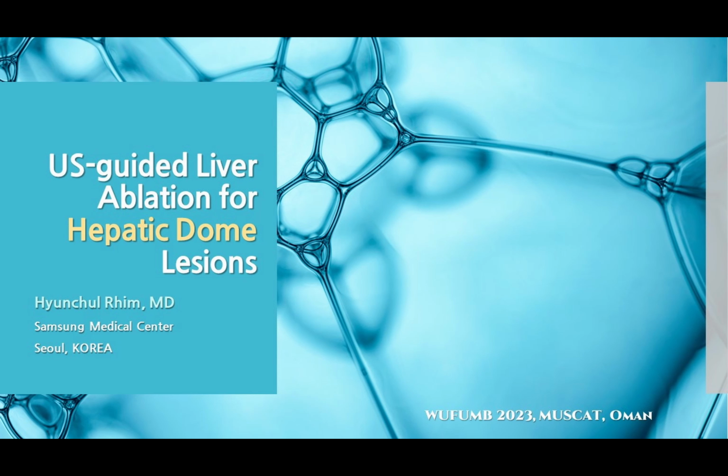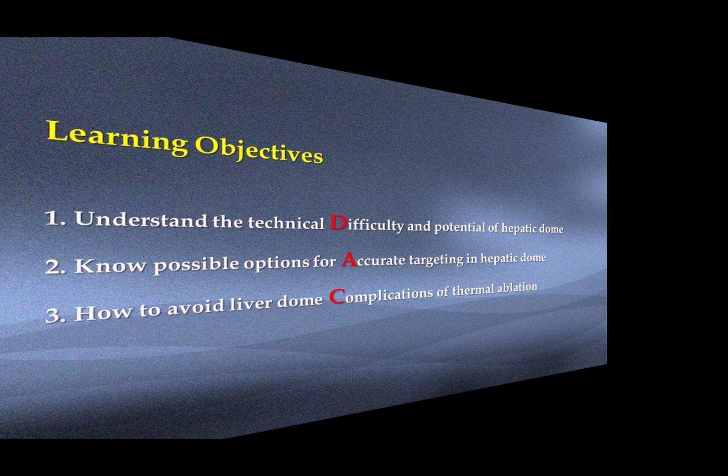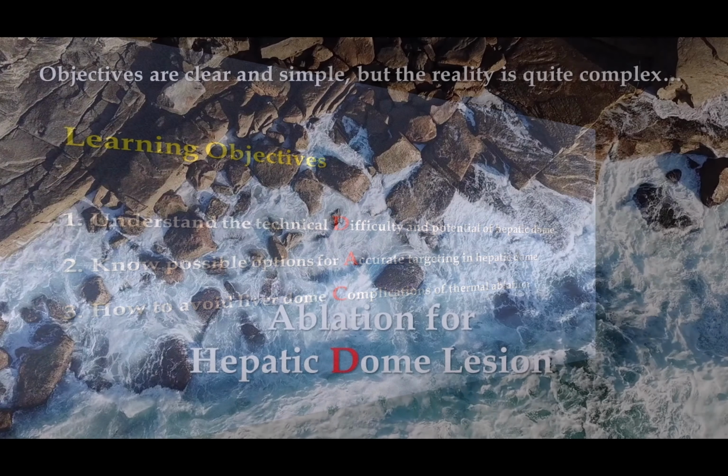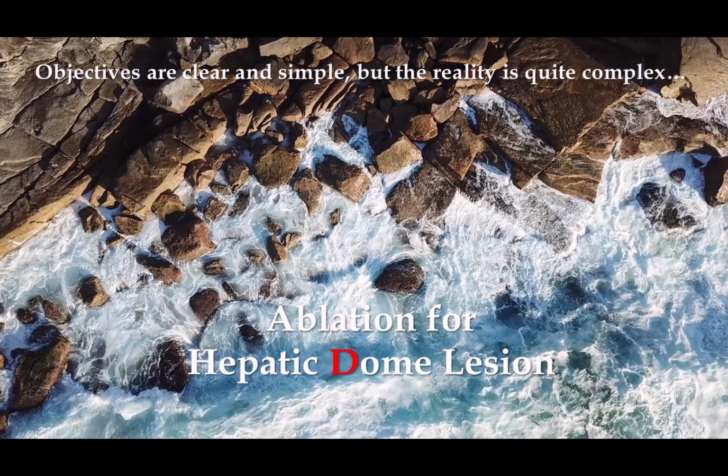Okay, my second topic is ultrasound-guided liver ablation for hepatic dome lesion. Fortunately, this is an 18-minute single video, so feel free and relax. So the objective is clear, but the real practice is not quite easy, very complex.